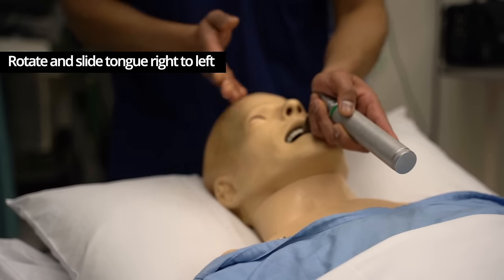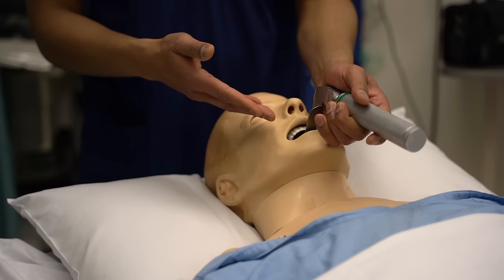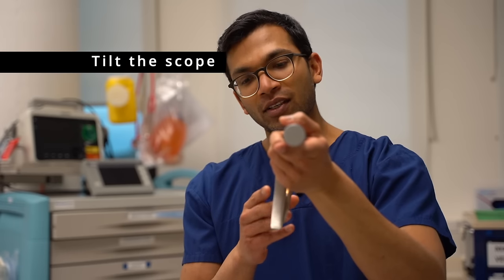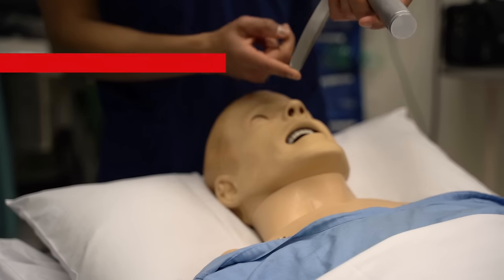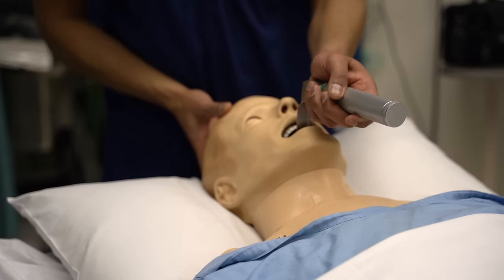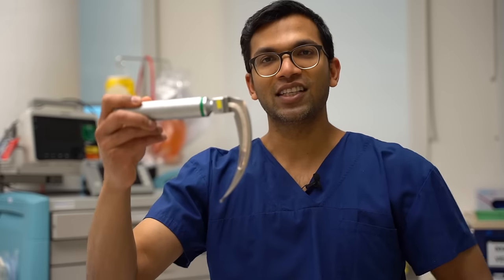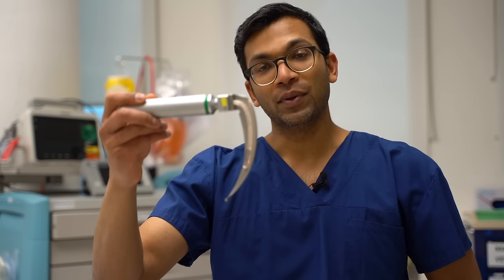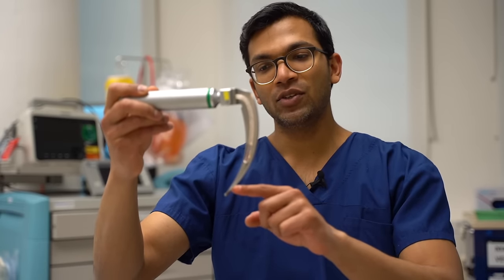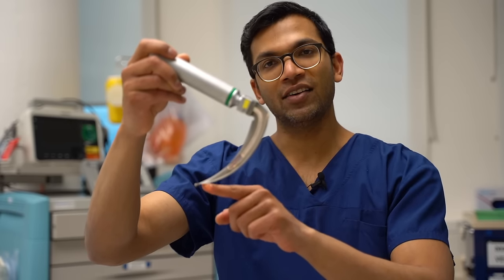The very next step is to slide the tongue from the right to the left. At this point I'm pretty much down straight back into the oropharynx, and I do a tilting motion — I'm trying to get that tip to trace down the tongue. The tongue is the road down to the vallecula, and I need to go all the way down into the vallecula, tilting on this axis. The laryngoscope blade is inside the oral cavity, straight back, and I'm rotating it on this axis as it traces down the tongue.